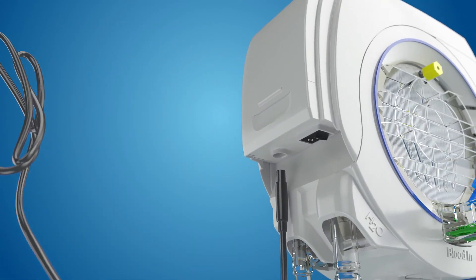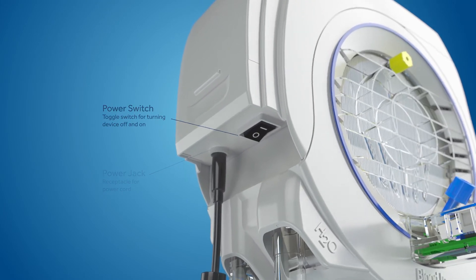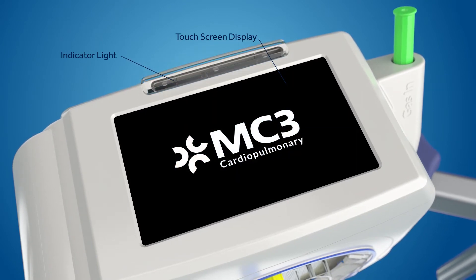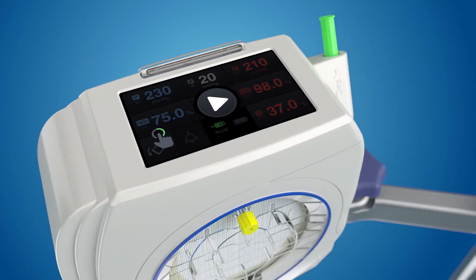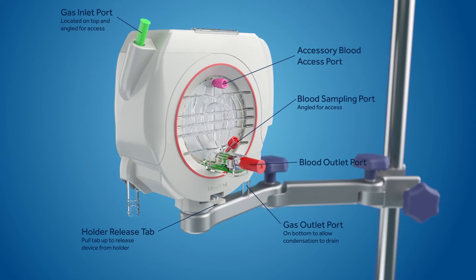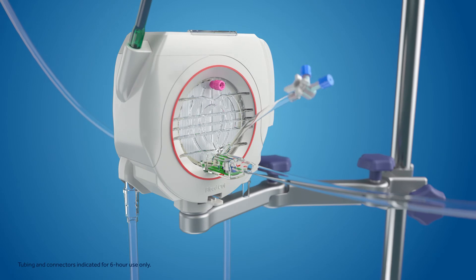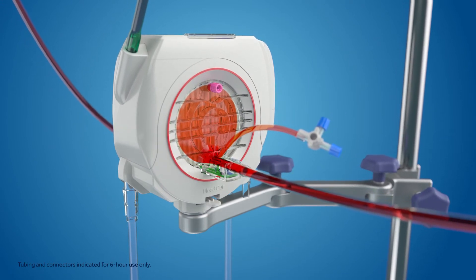To power on the module, flip the switch to the on position. As a convenience, pressure sensors are pre-zeroed and no further action is needed to ensure pressure sensors are zeroed prior to use. The large blue ring on the inlet side and the red ring on the outlet side match the colored caps on the blood inlet and outlet ports, helping confirm the inlet and outlet side once the colored caps have been removed.